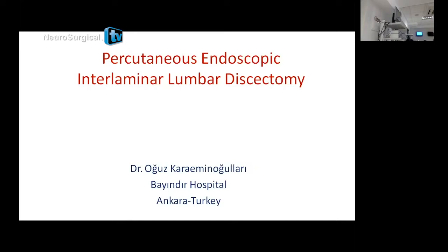So it's a combination of inside-out and outside-in. Actually, there are 2 main techniques. You can put your working cannula and endoscope to the inferior pedicle, and find the disc space and go to find the exiting nerve root. This is the technique where you use oblique one. This is Rutan's technique. Lumbar's technique: you go in the disc, go out, and turn to the foramen. And it's safer there. And then look for the fragment.